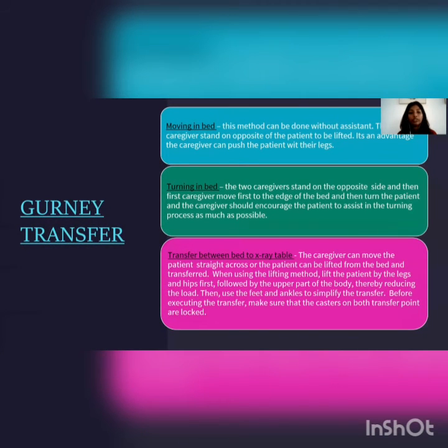Lastly, we will talk about gurney transfer. Gurney transfer has three types: moving in bed, turning in bed, and transfer between bed and X-ray table. Moving in bed is the method that can be done without extra assistance. It can be done with a single individual. The caregiver has to stand on the opposite side of the patient to be lifted. It's an advantage that the caregiver can push the patient with their legs. This is usually used when the patient is moving from one bed to another bed if the patient is found unconscious.